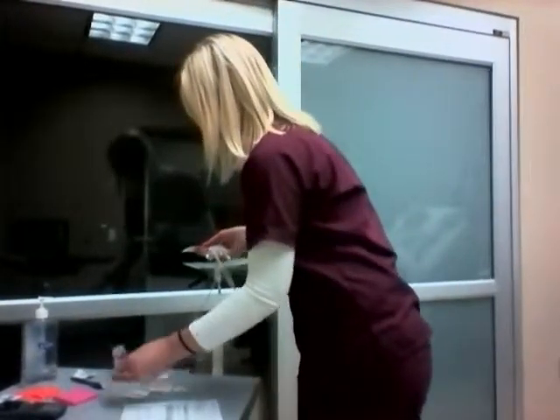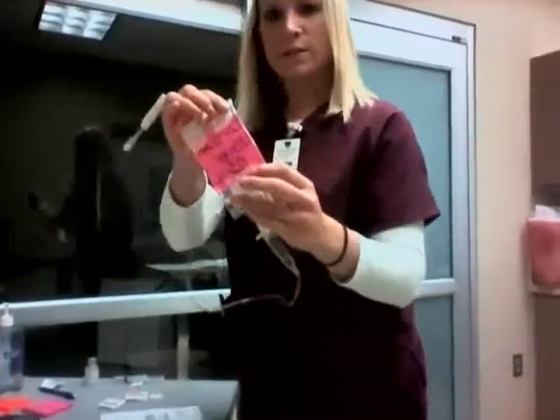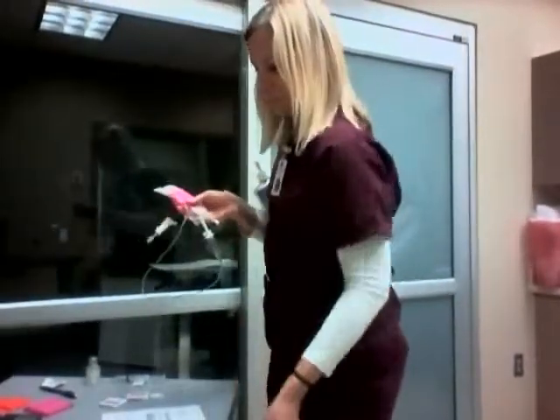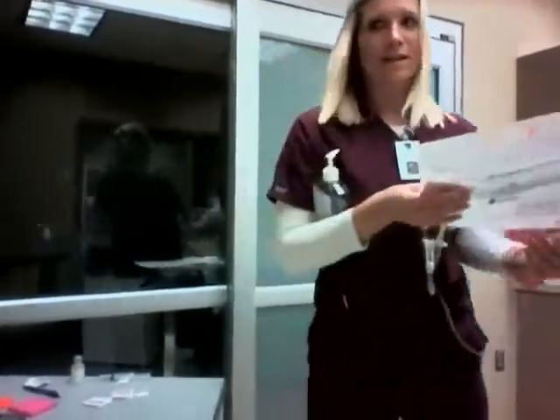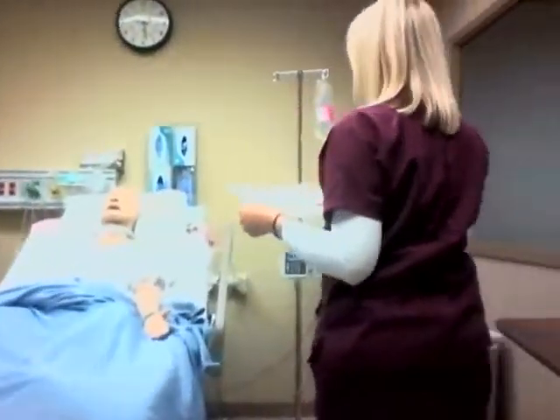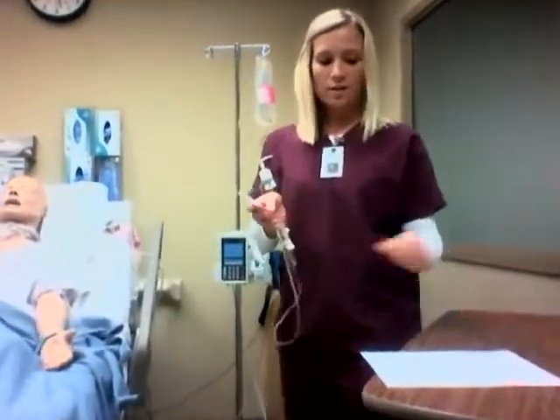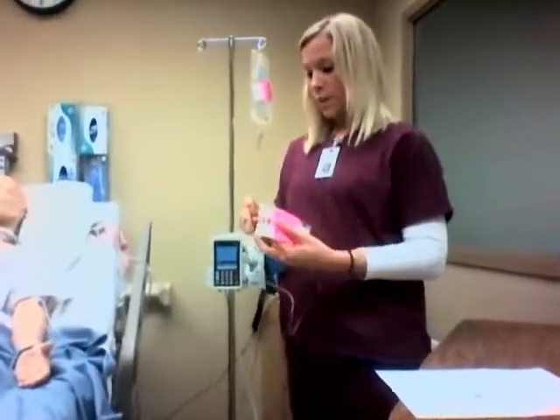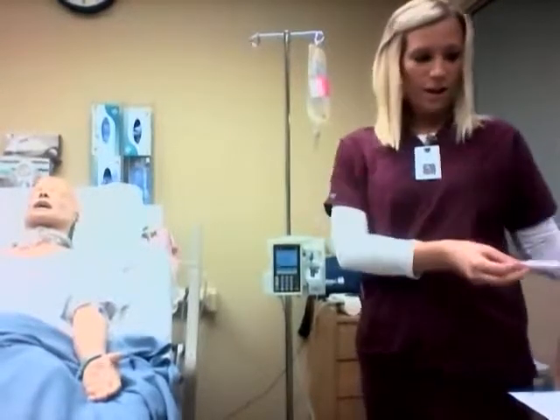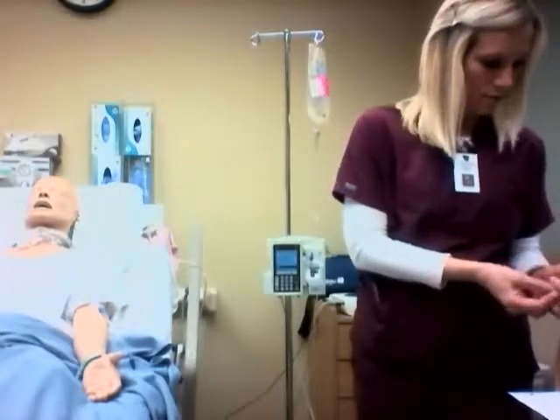And then we do have the right medication here. Right, so we will go to the patient's room. Hi, Mrs. Smith. It's Elise again, your nurse. I'm just here to hang the bag of Cardizem that we had just talked about a few minutes ago. Are you feeling okay after the IV push that I just did? Okay, good. You're not having any shortness of breath or chest pain? Okay, great. Thank you.